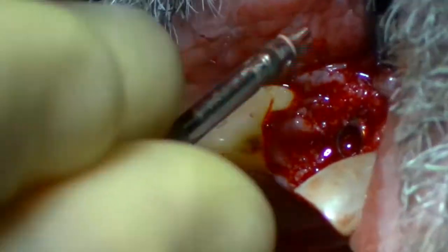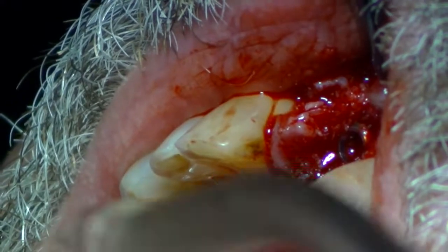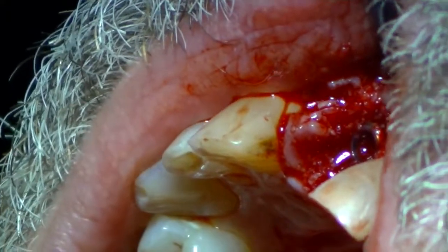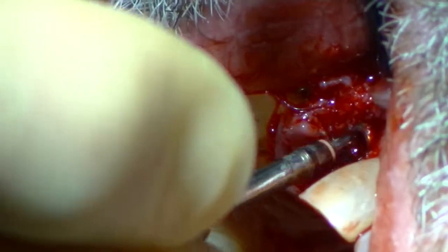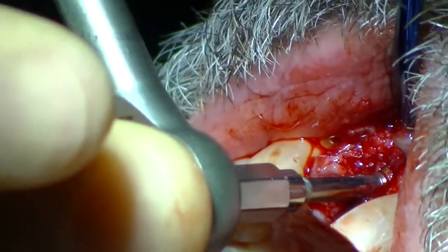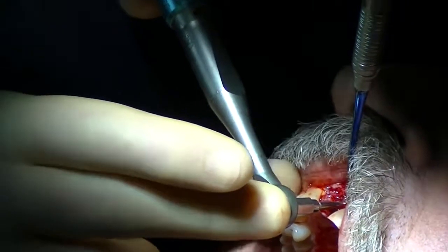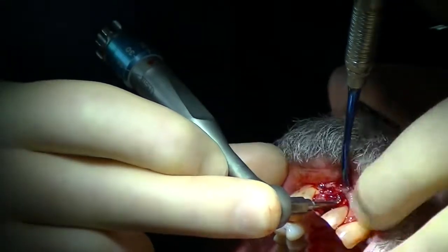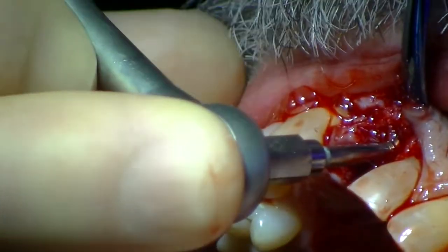I'm just going to go a little bit more here to check my torque. Hold that for a second, please. We were at 25, so I'm going to turn it back to 25. I'm just going to go a little bit deeper in that area. Yeah, that's awesome.